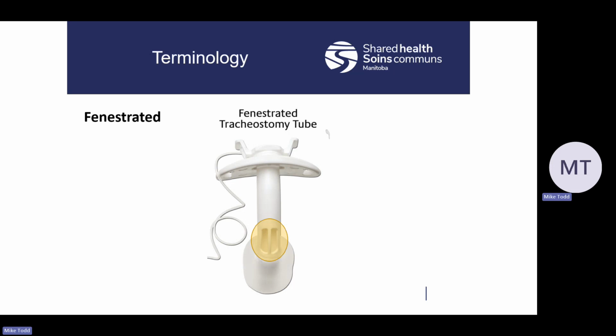This works for them because it allows them to talk. Because the air can move in and out, past the vocal cords at the back of the throat, or behind the tube, sorry, they are able to speak and communicate normally.